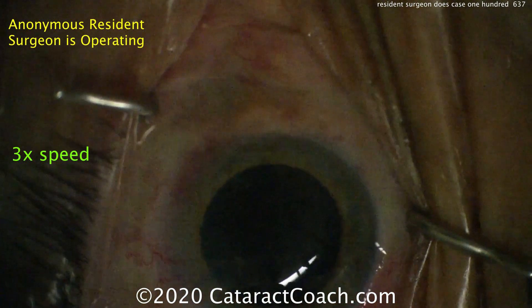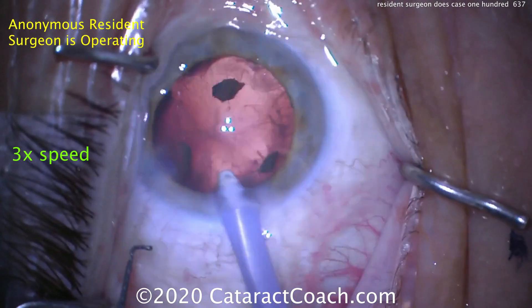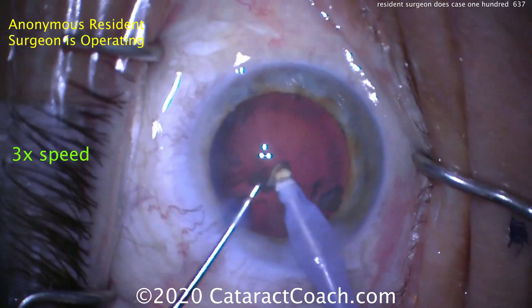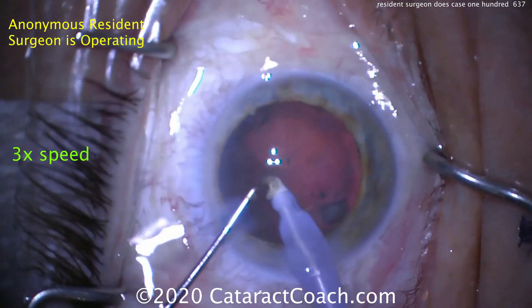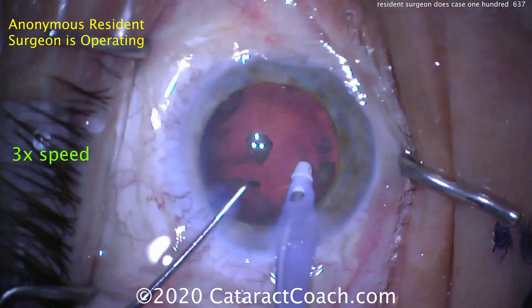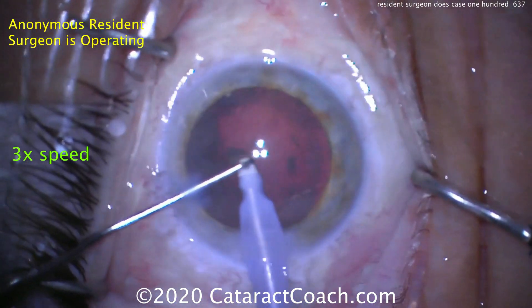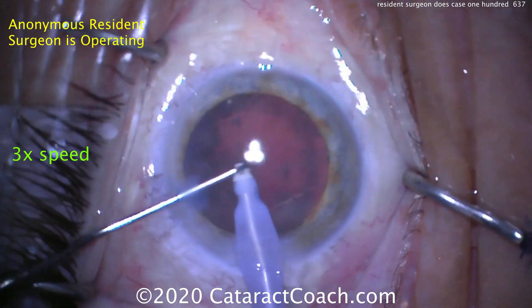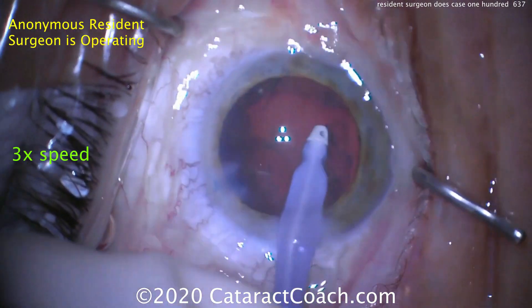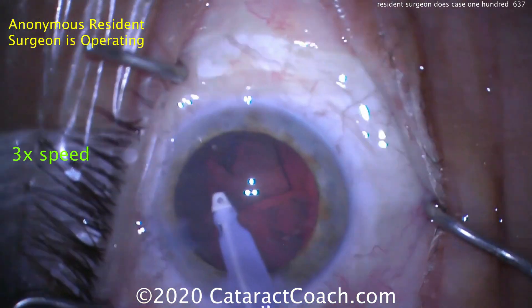The light's off here for a minute — looks like that's being done during the exchange to the IA tip. That's a very reasonable approach to avoid light toxicity. Here comes the IA tip. Those little pieces of nuclear chips can be just pushed into the port. I also like this polymer or plastic tip on the IA probe — that way you don't have any metal coming in contact with the capsule. Good technique here. I think this resident is well on his or her way to becoming an accomplished surgeon.